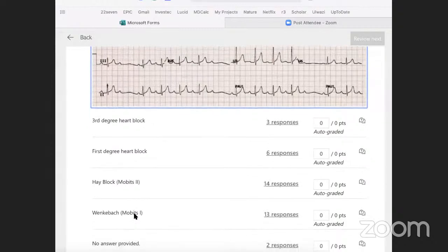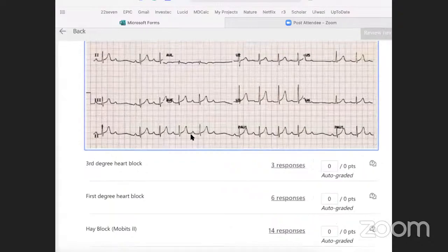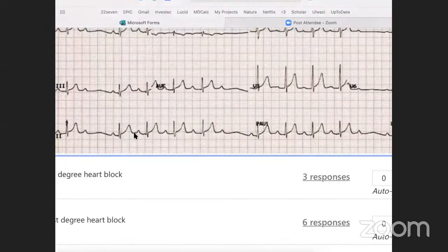And the challenge, why it's quite nice that we have such a split response between a type 1 or type 2. And so when you have an ECG that you're not too sure about, we mentioned the rule of 4s for checking our rhythm, but we can do that for our Ps as well. And so the P to P to P is going to be a shorter interval than our R to R to R. As small and as subtle as that is, it's a slightly widening gap.